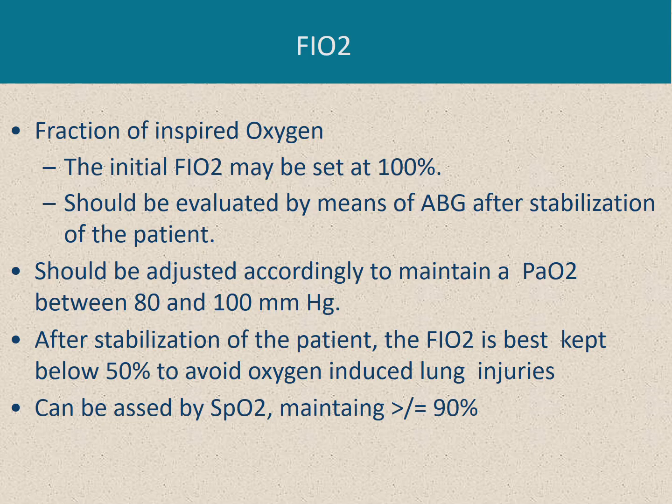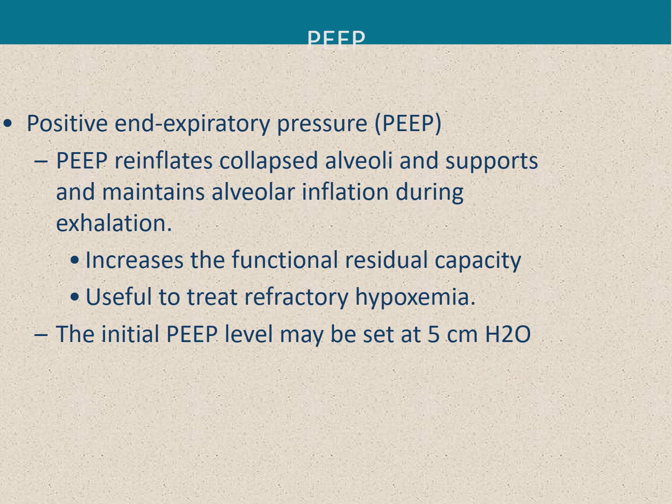After stabilization of the patient, we aim to reduce the FiO2, ideally to keep it below 50% to avoid oxygen-induced lung injury. And reduction of the delivered oxygen FiO2 can be assessed by maintaining a saturation above 90-95 or frequent blood gases.